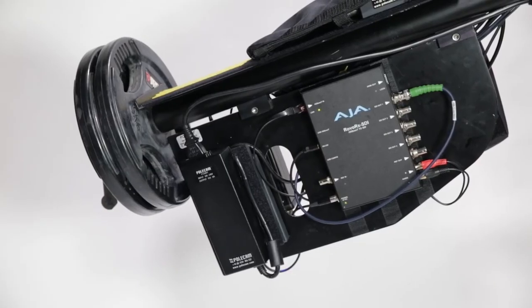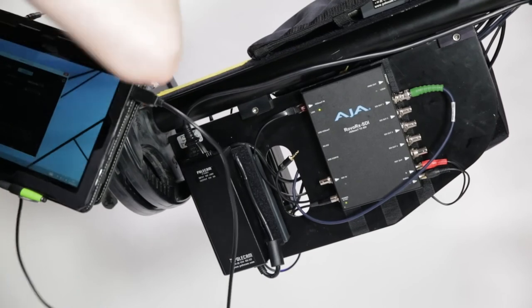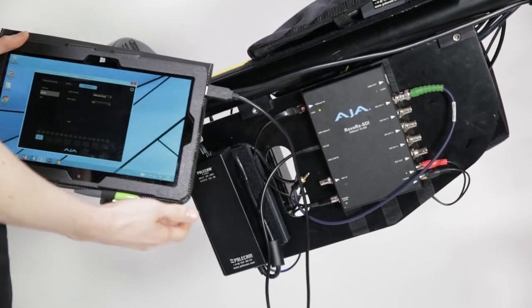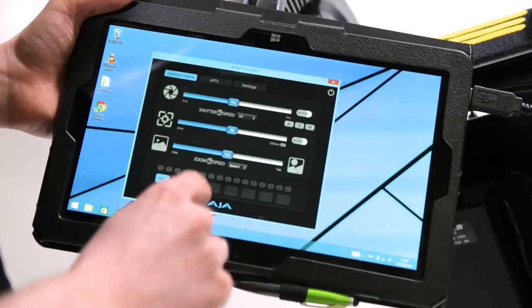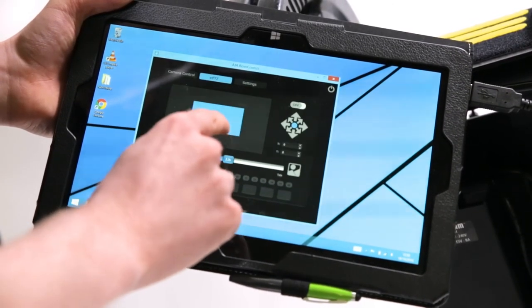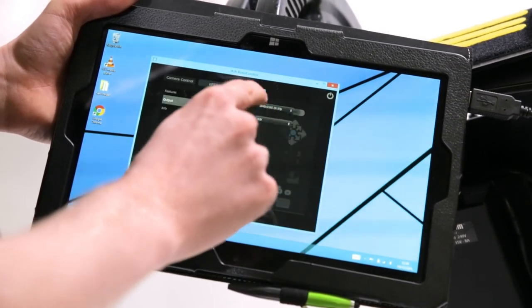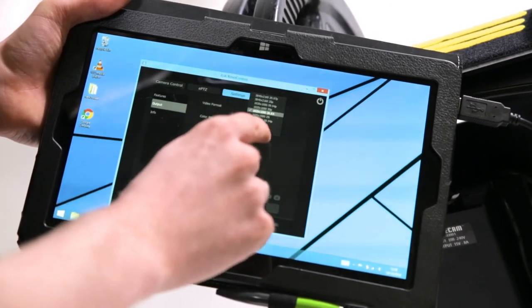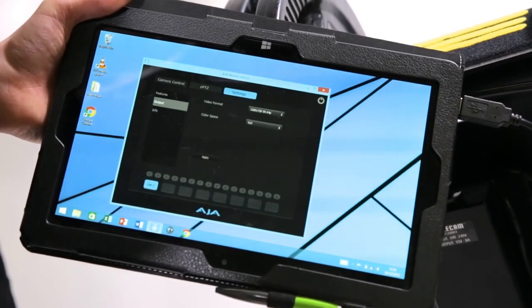For full control of the camera settings, you can connect your laptop or tablet PC to the RovoCam RX unit using the included USB to 3.5mm cable. Using the RovoCam app, you can update camera settings such as shutter speed and aperture, control your zoom, and more importantly change the output format of the SDI connections.